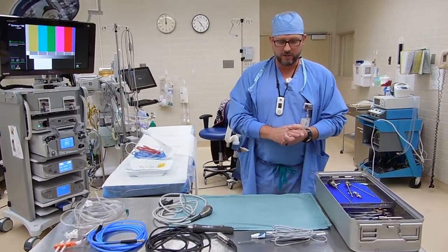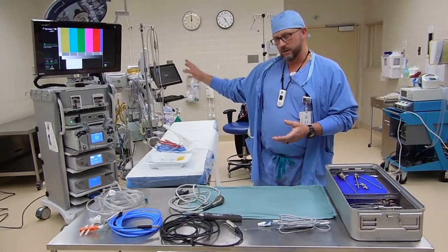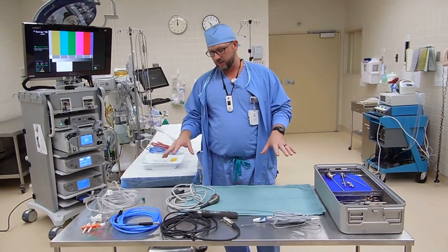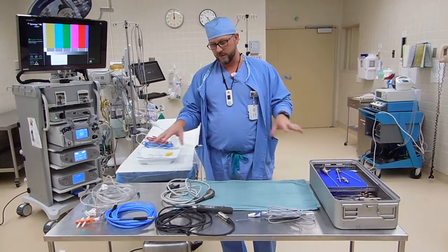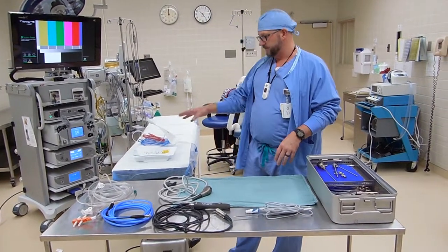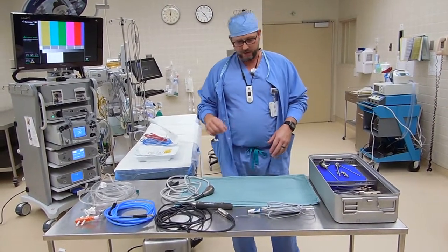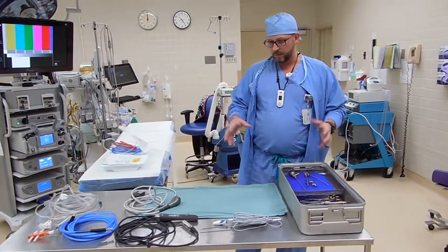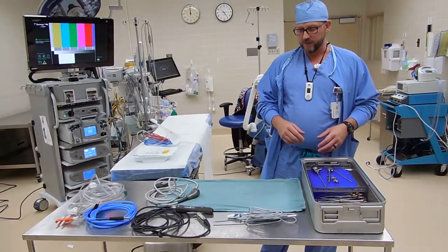Hi, it's Ken here. We're going to do a little video to go along with our Arthrex video about the tower setup on how to set up for shoulder and knee arthroscopies with the systems that we have here. We'll go over a few things that are confusing or difficult to put together.